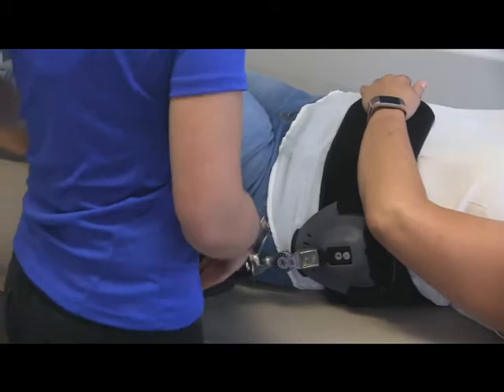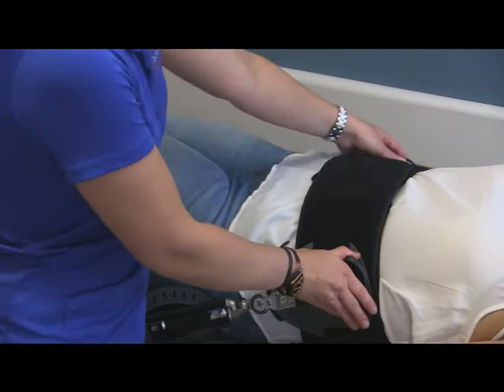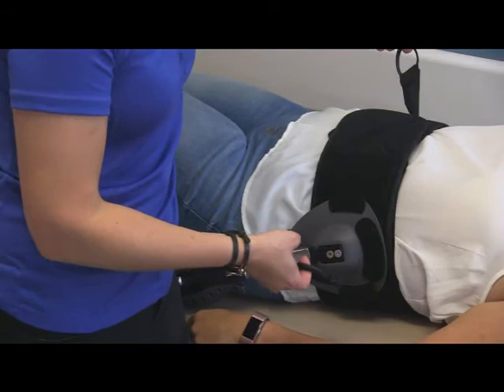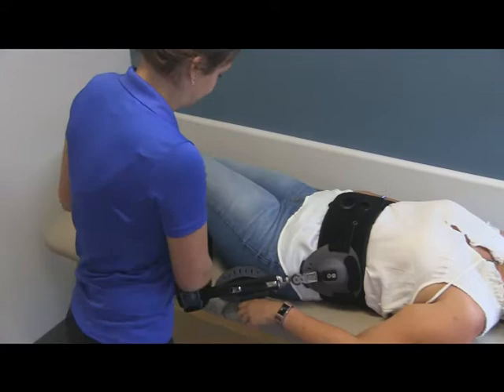We are then going to have the patient roll back lying flat, and then we are going to overlap the waist belt in front. There are two additional straps on either side of the waist belt that help to cinch and hold the brace into place. The brace is meant to be worn snug, but the patient should be able to still take a nice deep breath.